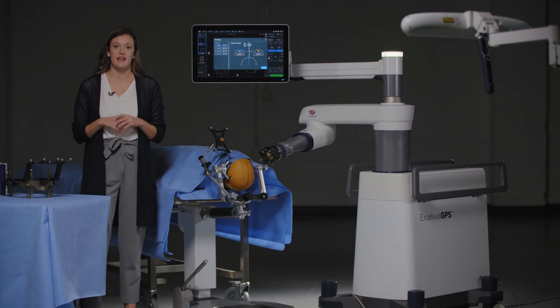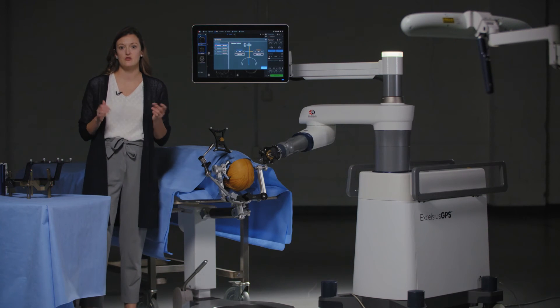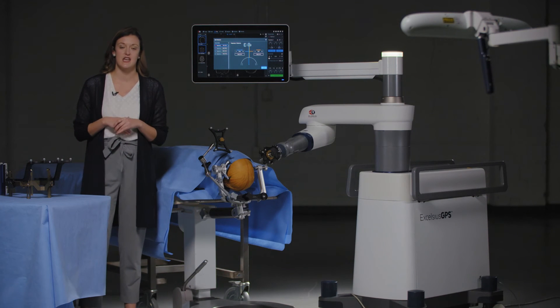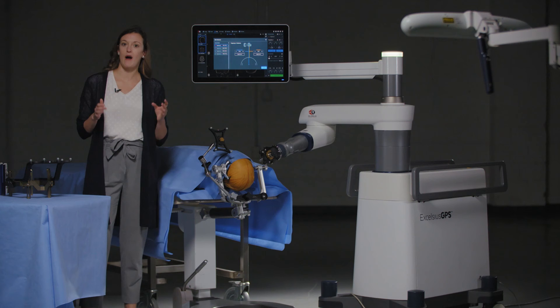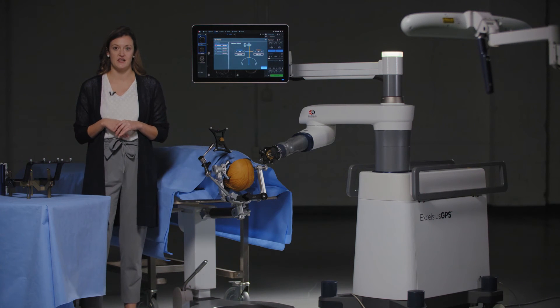With the preferred navigation setup and imaging modality, you are able to register the patient intraoperatively in a seamless manner for a wide variety of cranial stereotactic procedures.